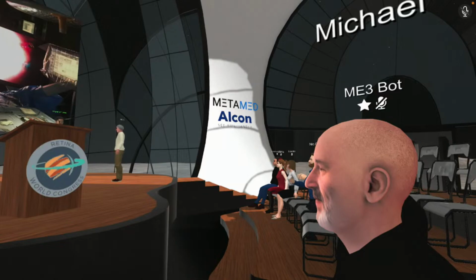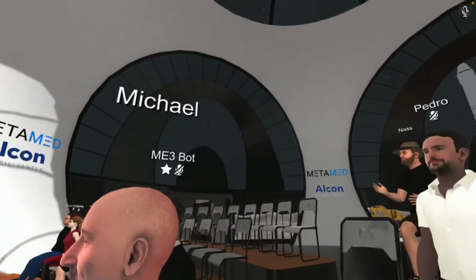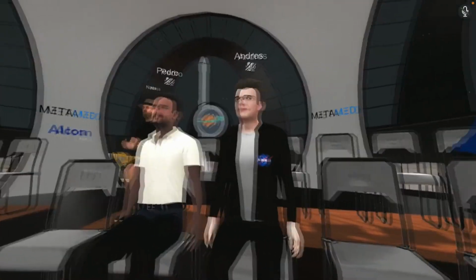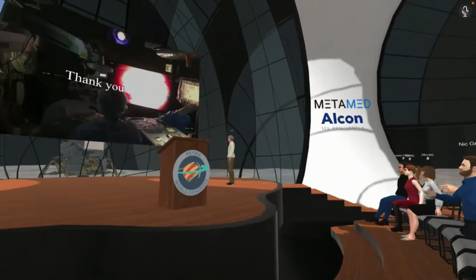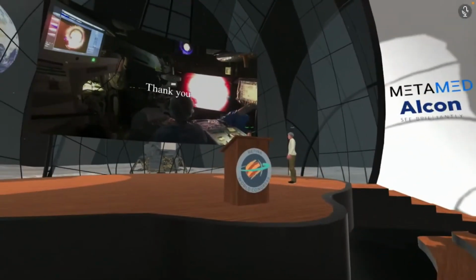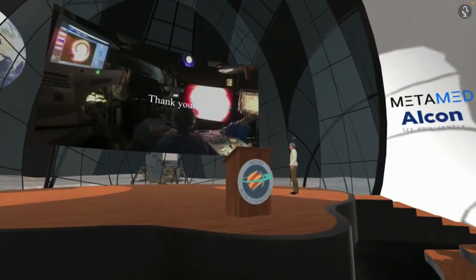I think to use the chandelier light is effective for that purpose. But if you want to observe more detail of the macula, to use the straight light is effective, I think. So we can use both.